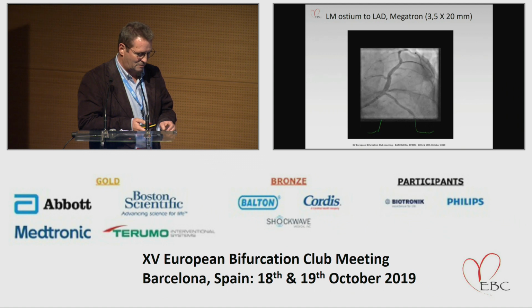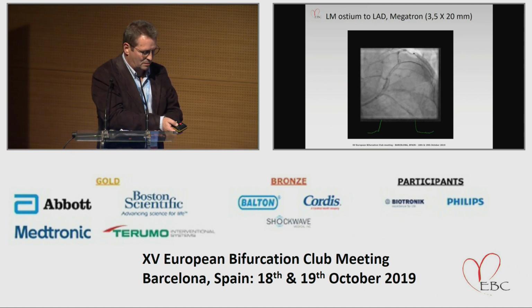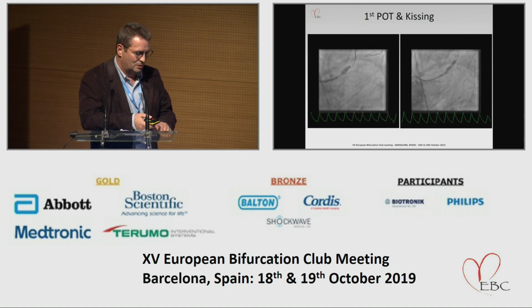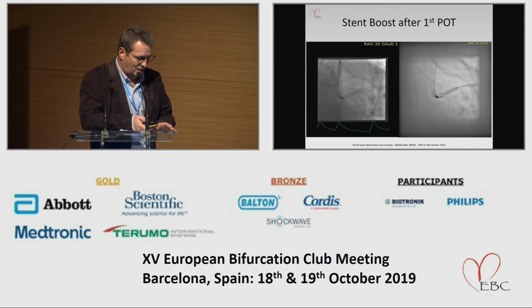So after that, we had the result, and we did the POT, as you can see, with a non-compliant 5.0 balloon, placed exactly as we used to, and then we did a KISS.